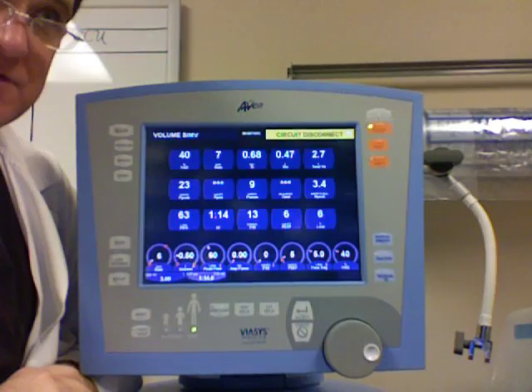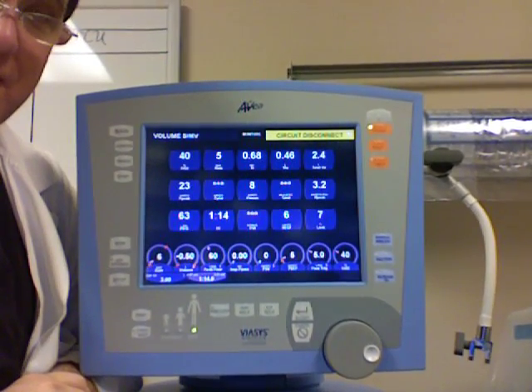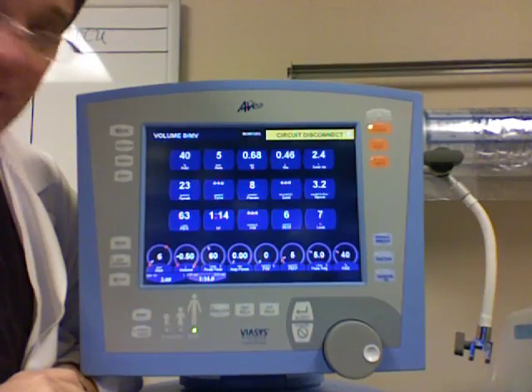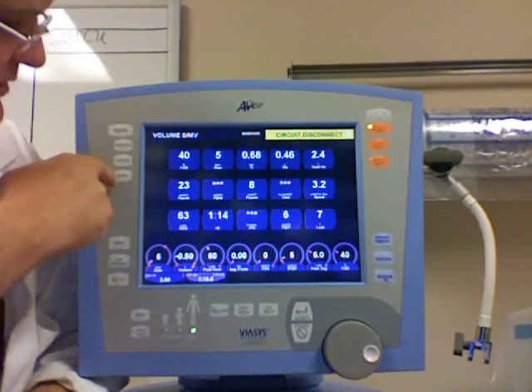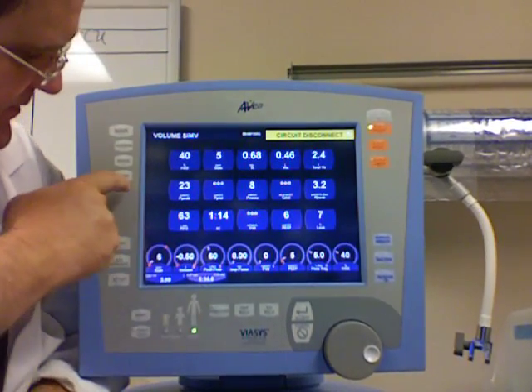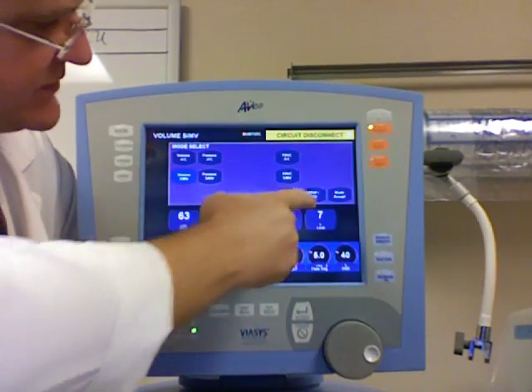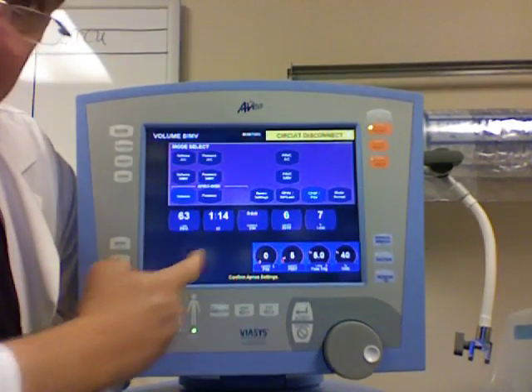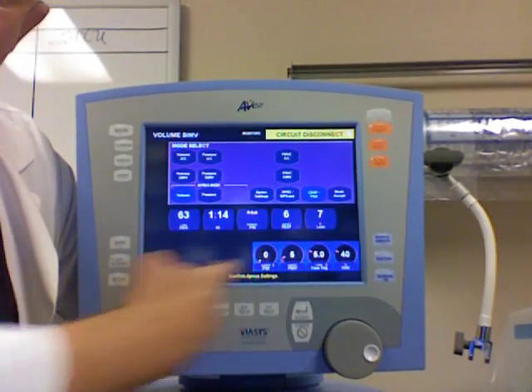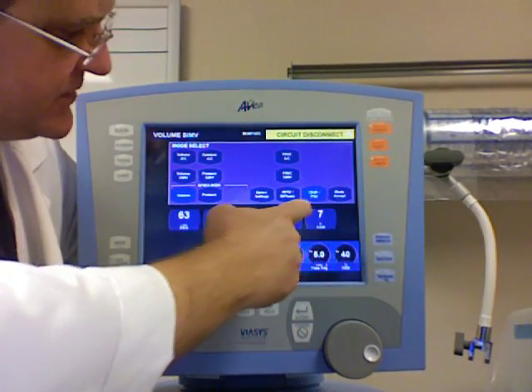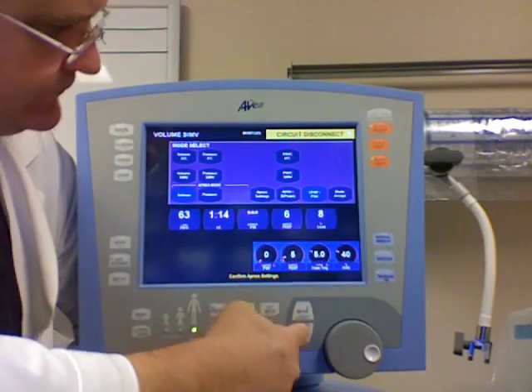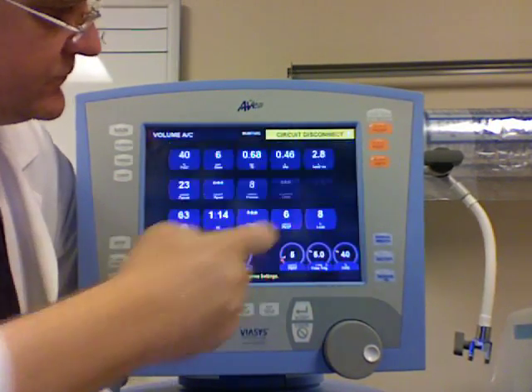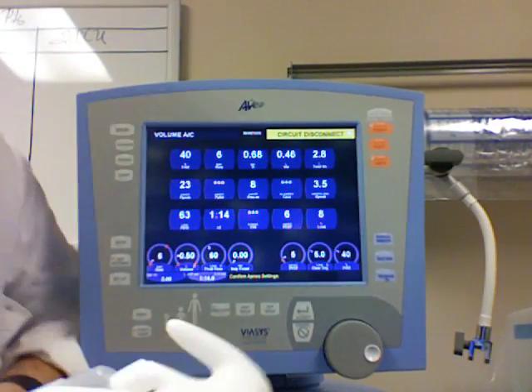And finally you have CPAP — the third mode — where the patient breathes completely on their own and they're getting nothing from the vent. There's no set rate. In fact, notice these things that disappear when I change over to CPAP: the set rate, the set tidal volume, and the peak flow rate all disappear. Let me cancel that and go back to assist control.